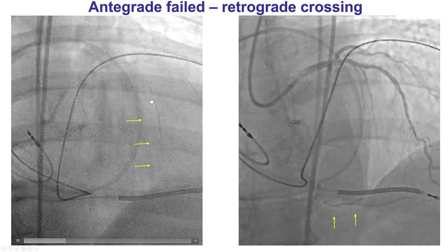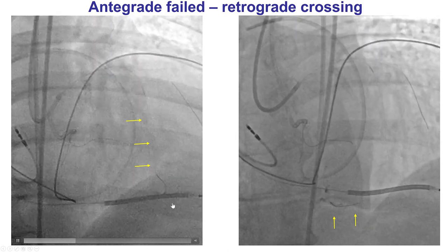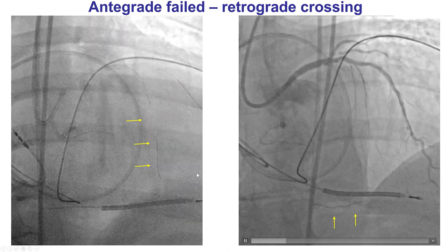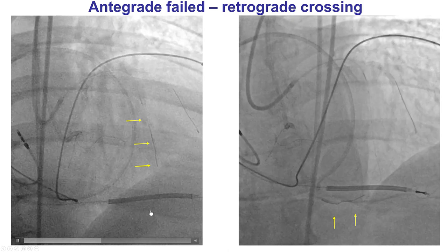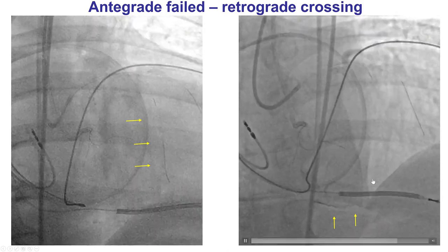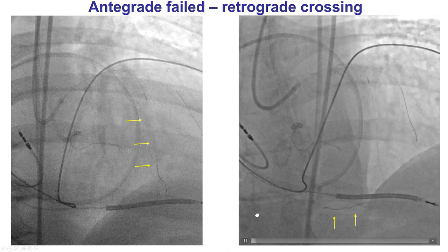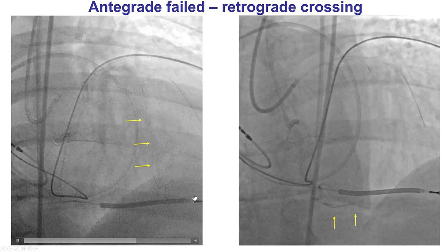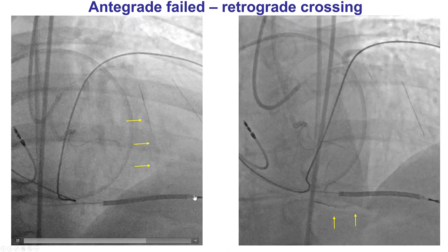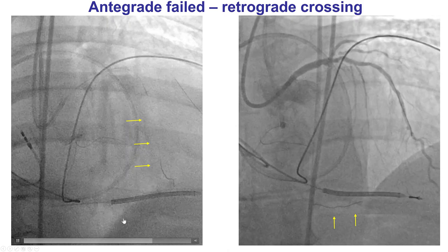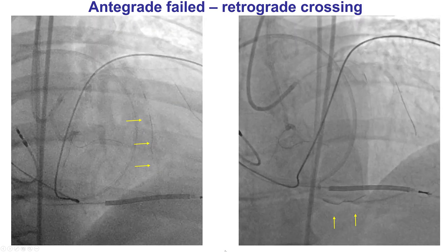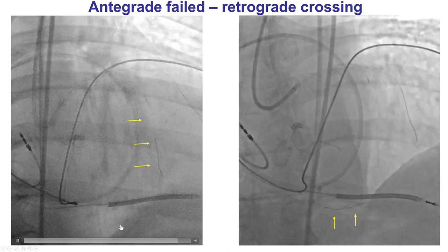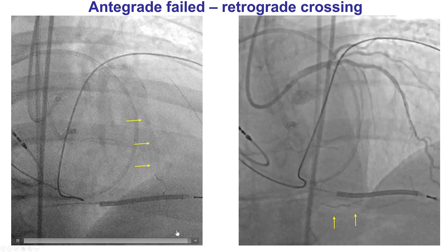A Caravelle microcatheter and various guide wires were used for crossing using the surfing technique. Eventually there was successful crossing into the right posterior descending artery, as confirmed by contralateral injection. A contrast injection can also guide guide wire manipulation, especially if there is delay in the surfing technique, or when choosing among several septal collaterals — selecting the least tortuous and largest in caliber.